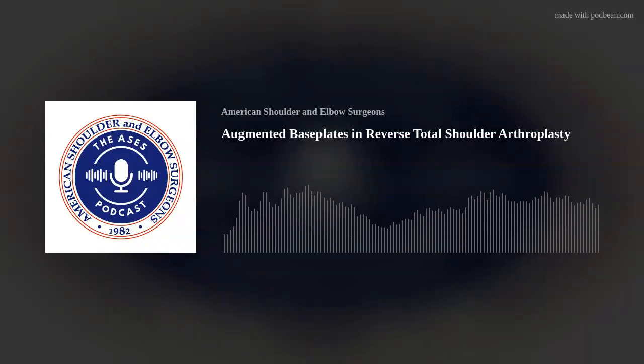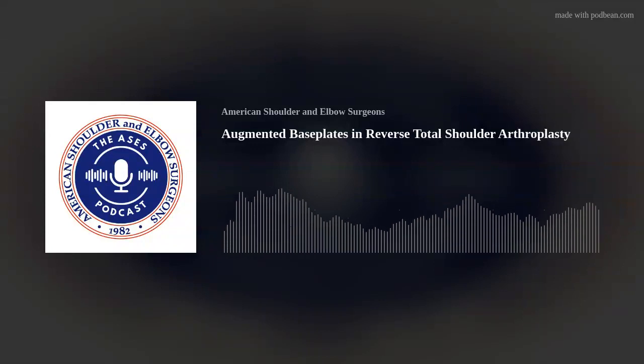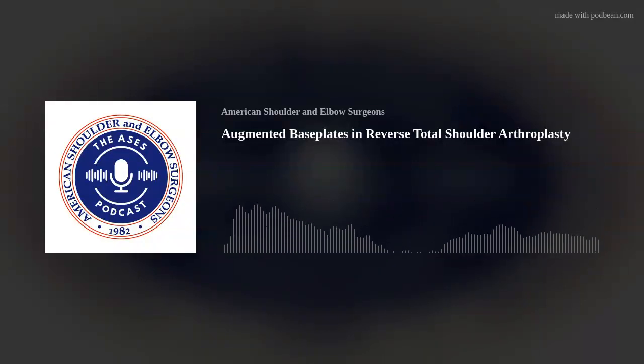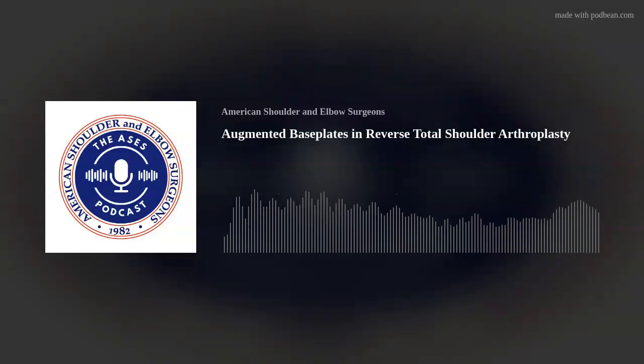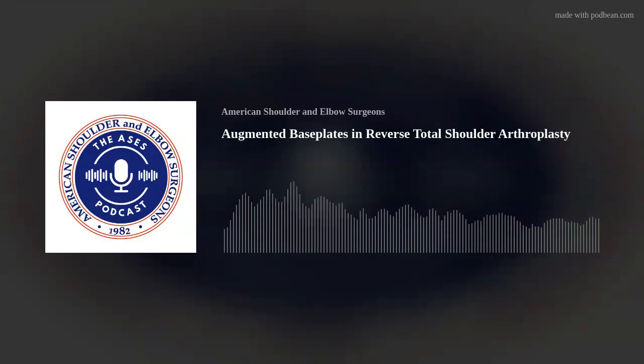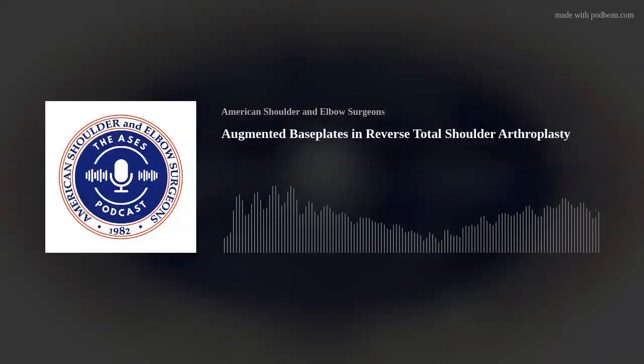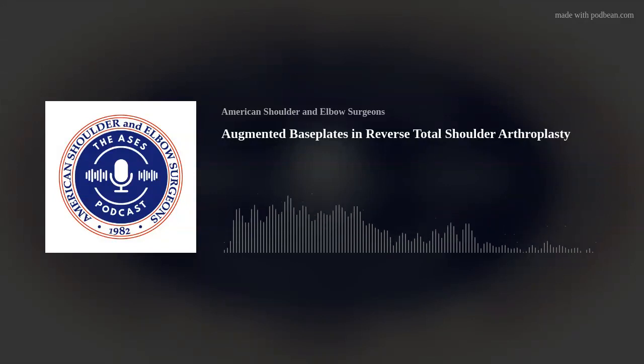Yeah, I think they echo some of what Joe said and some of the thoughts I said before, which is I think we just adapt to our different systems. I have a system that right now I can actually use augment on the fly or just use a regular base plate. And sometimes I do, and sometimes I don't. And before I use bone graft, my goal was to tilt it down. We can talk a little bit more about how far, but I think we as surgeons get to a place the way that we know how to, and we adapt accordingly.